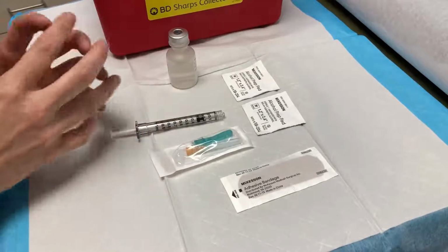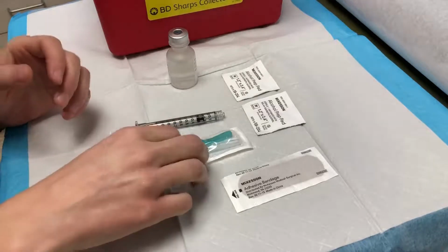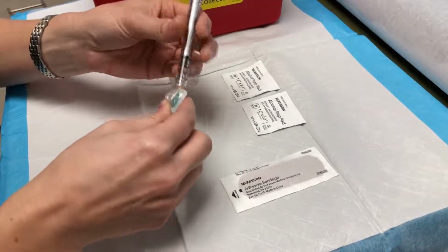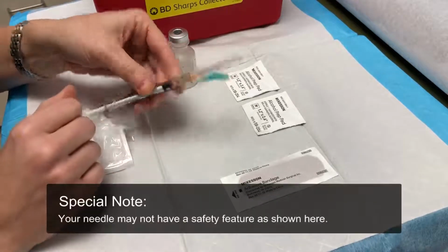And now we're going to prepare our syringe to perform our injection. A good sized needle is a 25 gauge 5/8 inch needle to perform a subcutaneous injection. So twisting from the base, apply your needle and pull your safety feature out of the way. Set your needle down.